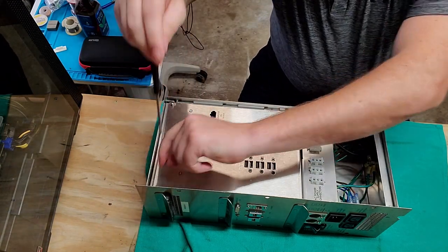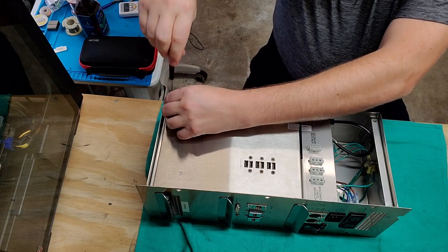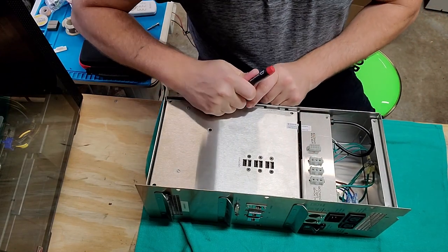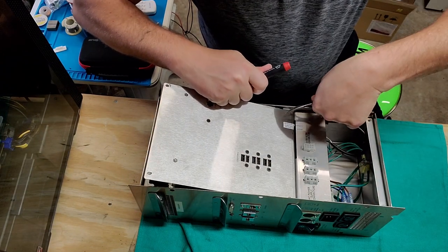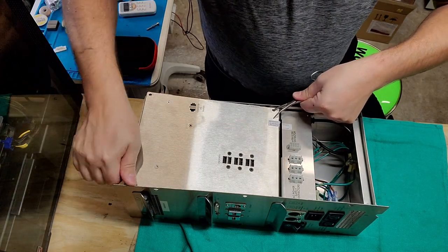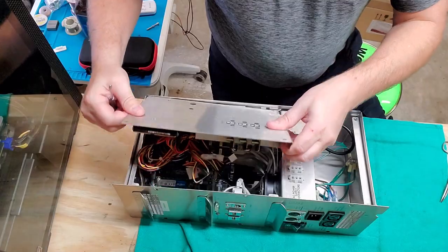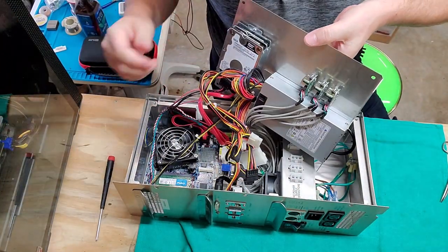All right, well, this is going to be a small form factor motherboard, probably, or custom. So let's figure out what type of motherboard we got. It looks like there's slots, so we slide it and then lift. Okay, there we go. All right, here we are. Oh, wow. Okay. Let me get this guy out of the slots entirely. Wow, I never would have guessed that.